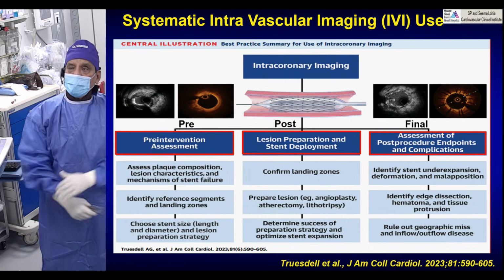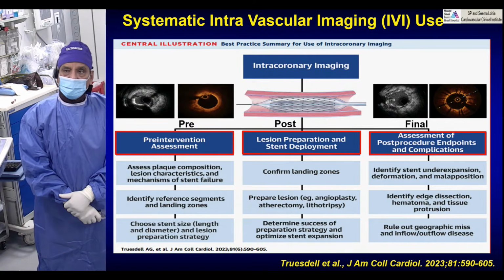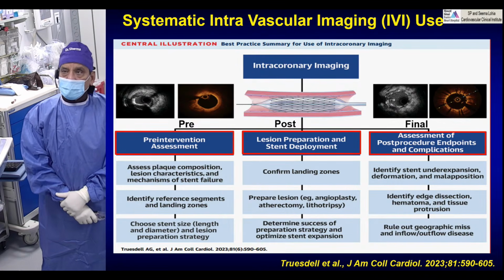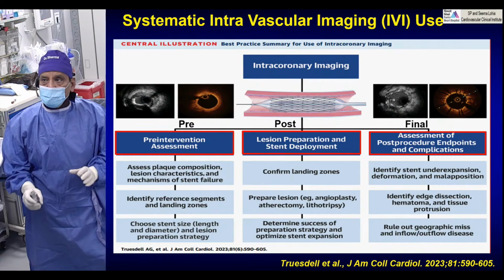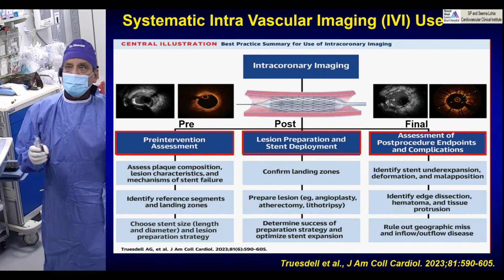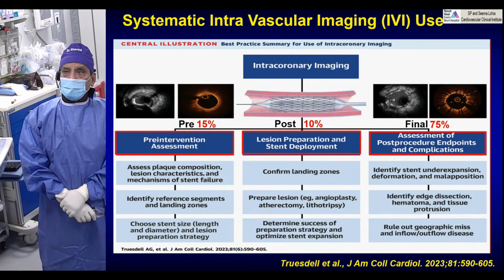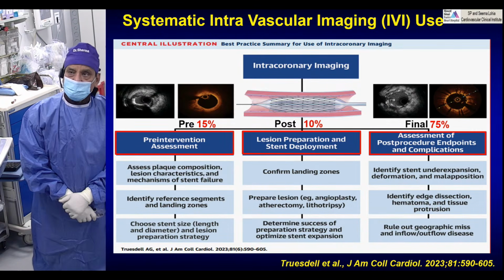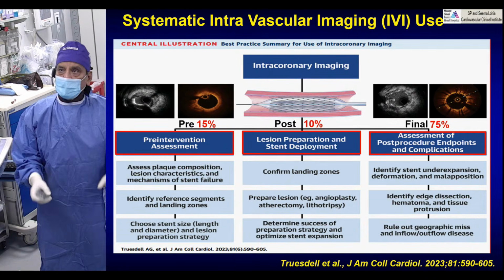Now this is one. Second, as we spoke about, pre, post, and final. Pre-intervention assessment, which we did, then confirm during the procedure, which is post, and then the final. To me, a lot of people have a different opinion about the contributing factor for which one. I can tell you from my point of view, I feel that pre is important, post is very little, and the ultimate is the final. People may disagree, but that is what I feel.